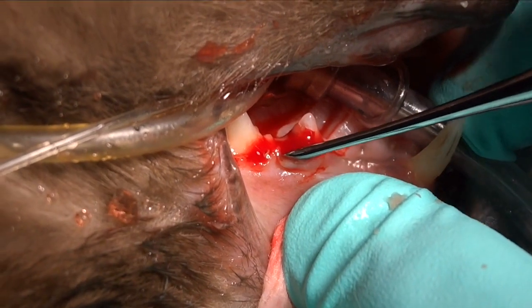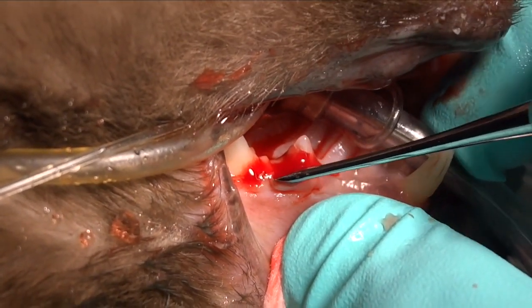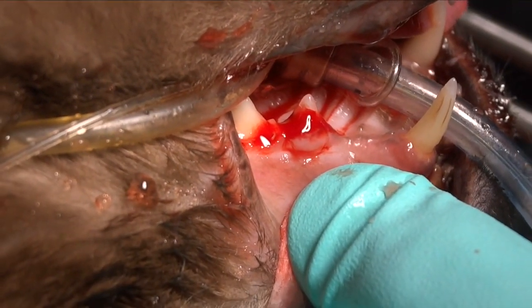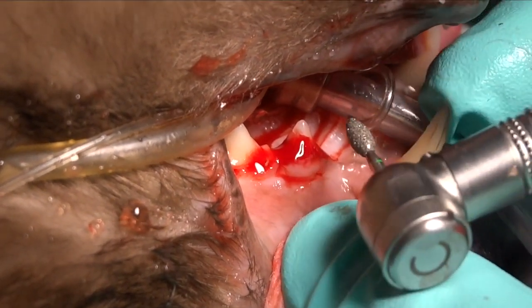So when we come in with our burr we're not going to ding that gingiva, and it will be safe to remove the tooth and whatever root structure is there that's abnormal.